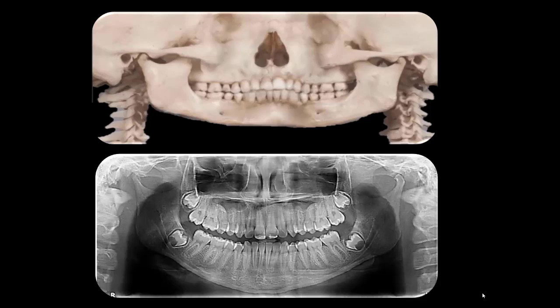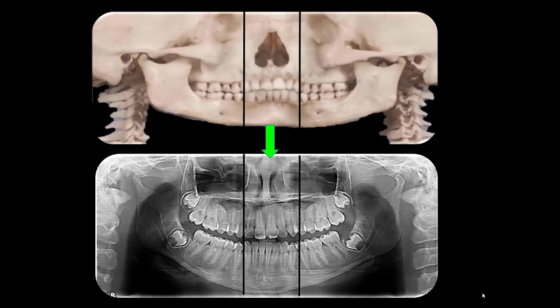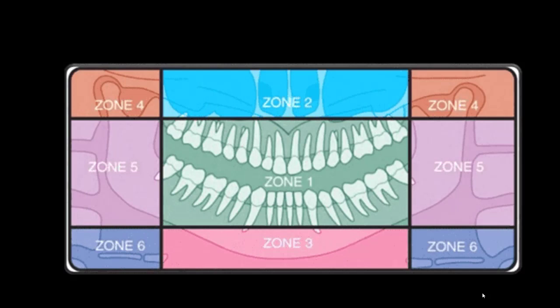On the part 1 video, we talked about what a panoramic radiograph is — it's like opening the skull and looking at it. The middle part looks like an anterior-posterior radiograph and the sides look like lateral radiographs. We talked about six zones that we can divide a panoramic radiograph into, so while reading and interpreting it you won't miss any part. We talked about the anatomical landmarks in zones 4, 5, and 6.